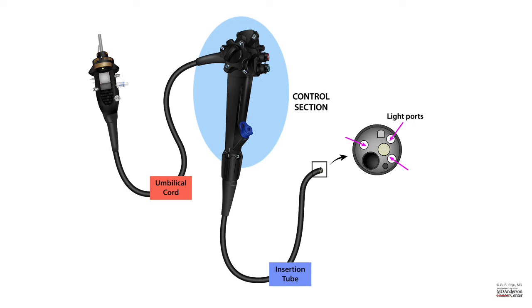Here is the light guide or the light port, and if you are wondering where does the light come from, when you hook up the umbilical cord to the processor, the light guide goes in there and the light from the processor is delivered through the umbilical cord down the insertion tube.